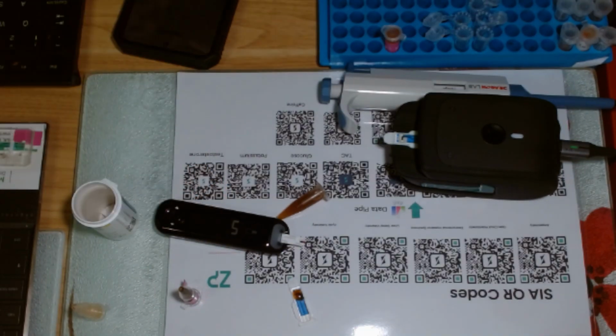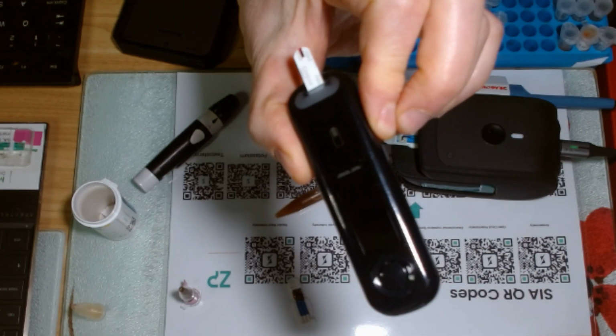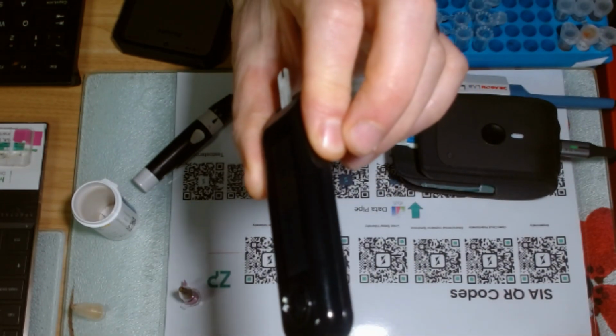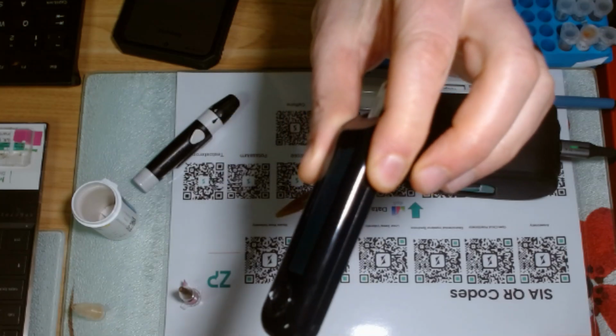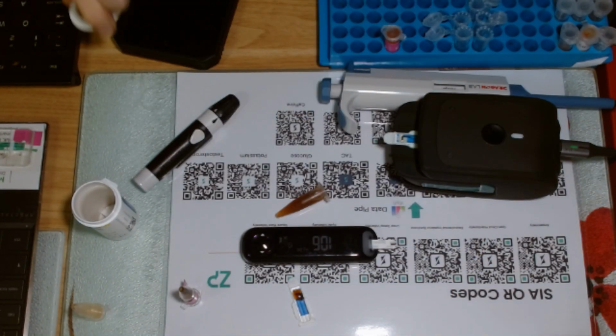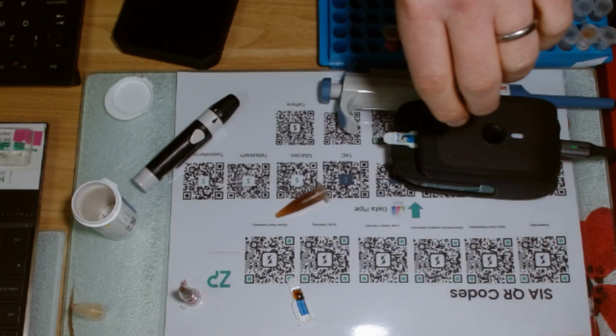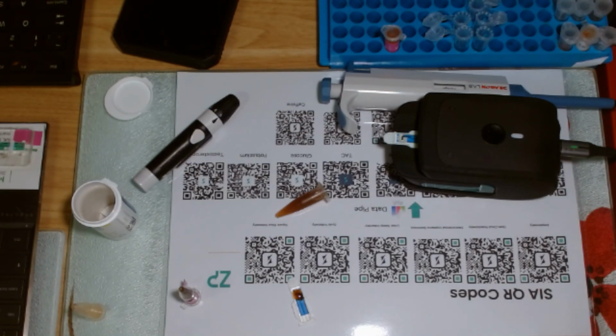Now the reason I do that is because this meter will give you a measurement of blood, and I got 106 milligrams per dL. The reason I bring that up is because it's designed to work with blood, so it's got a very specific kind of workflow. Prick your finger, put a drop of blood on there, get your result.